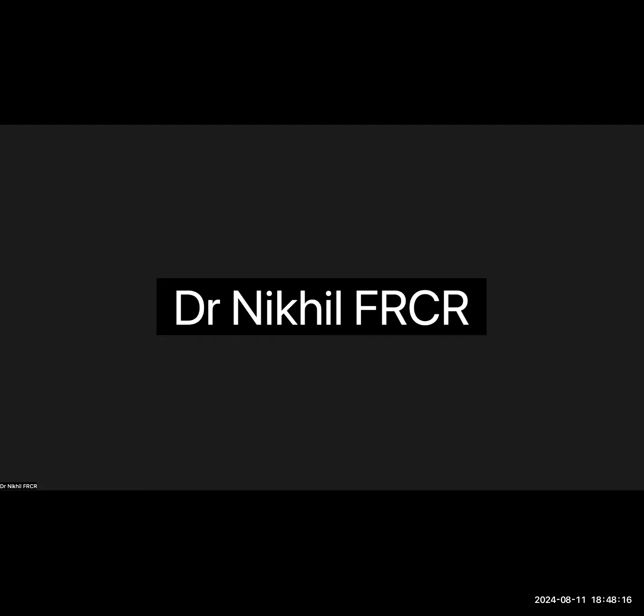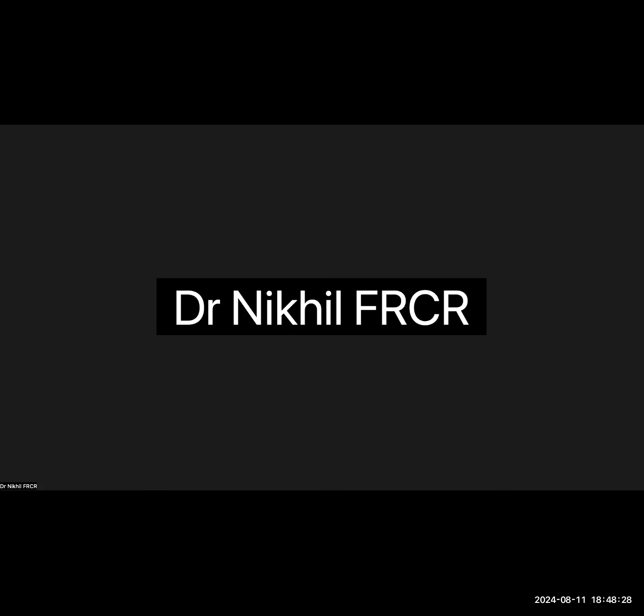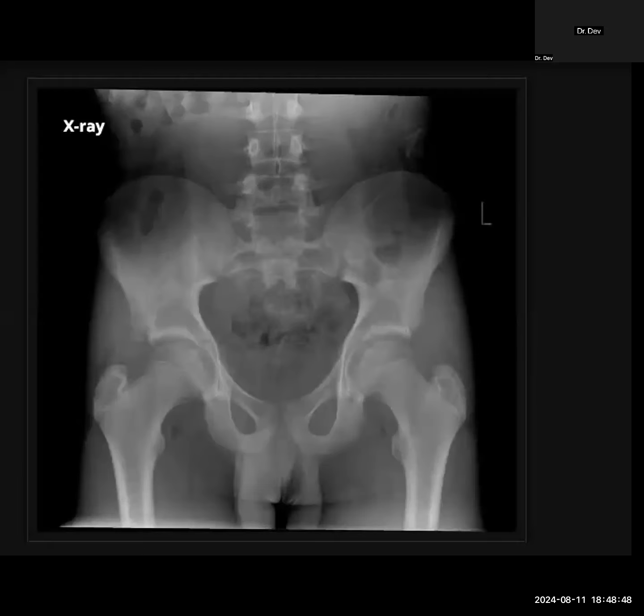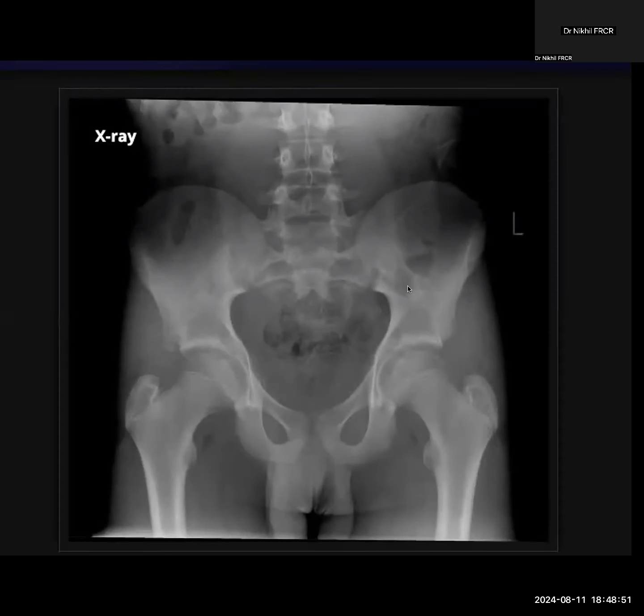If candidate B is ready, I think we can go ahead with the first case. Shall we start, candidate B? Yes. Okay, cool. I think we have a question from Dr. Priya: in Paget's, was there a lytic lesion? I'll answer that. You can go ahead. So this is your first case, candidate B. You can start.